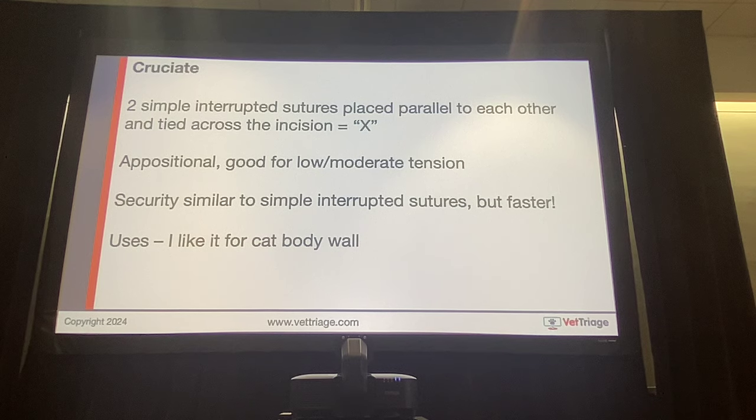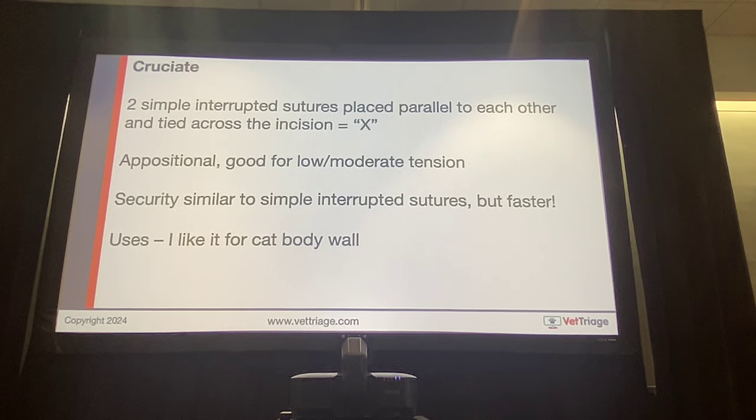So most of us, we're experienced with suture knot and knot security, 3-4 is sufficient. In areas of the body that either I'm really worried about it, because maybe the area was inherently infected, or I'm worried about leftover cancer cells, I may go more. I may go 5-6. Yeah, it depends. It also depends on what suture material you're using, because some degrade much faster, and so the surgeons feel better placing more sutures. But I usually only place that many if I'm worried about the friability of the tissue for whatever reason. Bad anatomic location, infection, cancer left behind, then I'll place more knots.